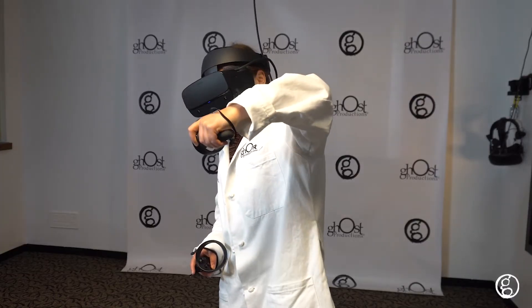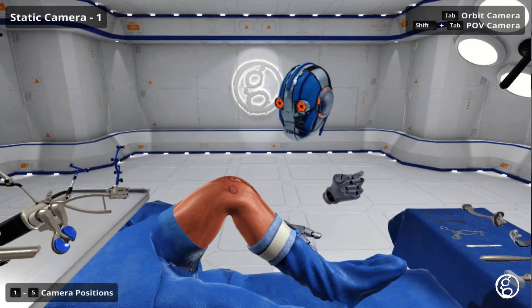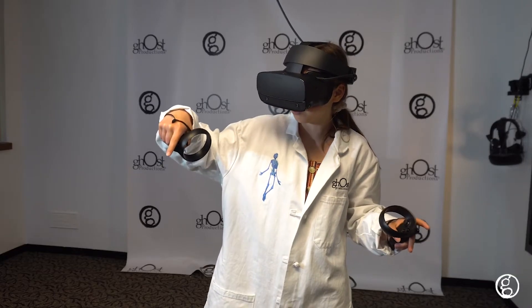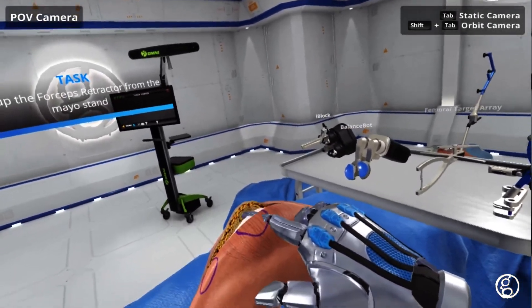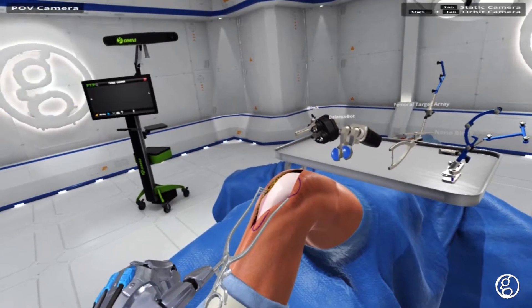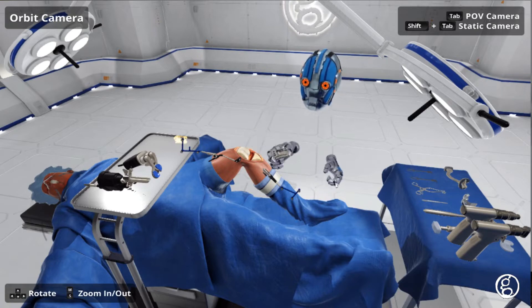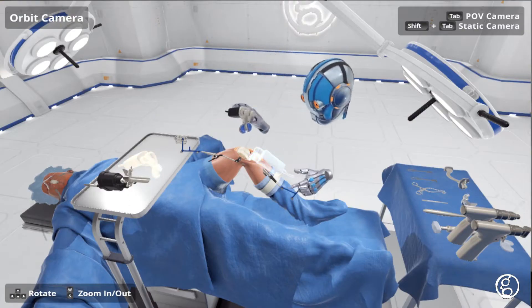This is my first time cutting open. Continuing down to the tibial — you may probe the margins of the incision with your finger. Use the retractor to retract this. Turn it to the Mayo stand and setting the robotic paddles into the joint space on the resected tibia.